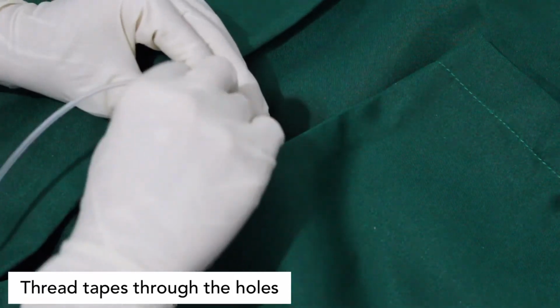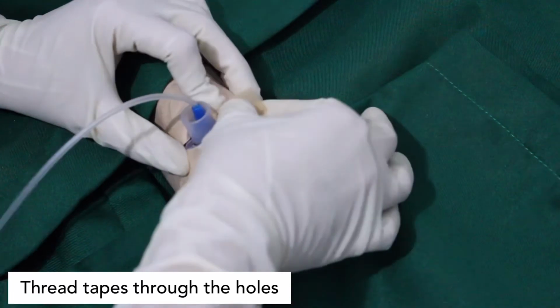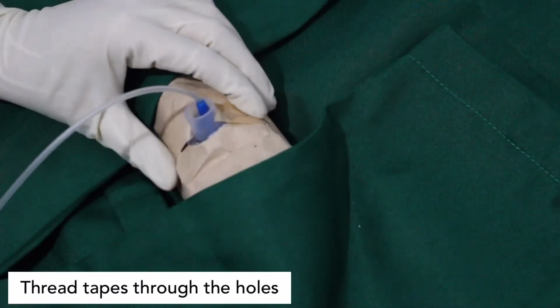Thread tapes through the holes in the flanges of the tracheostomy tube and pass them around the neck. Tie them with the neck flexed.